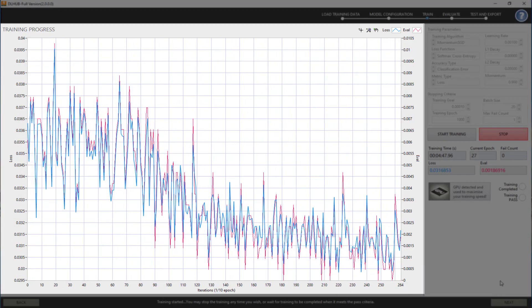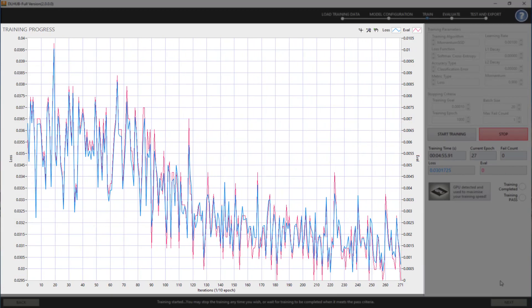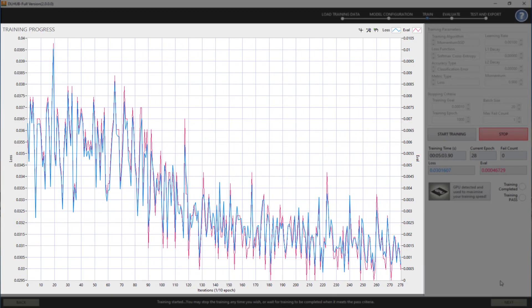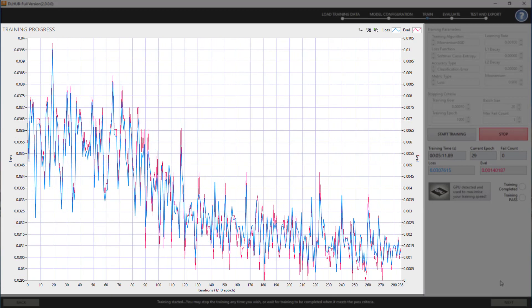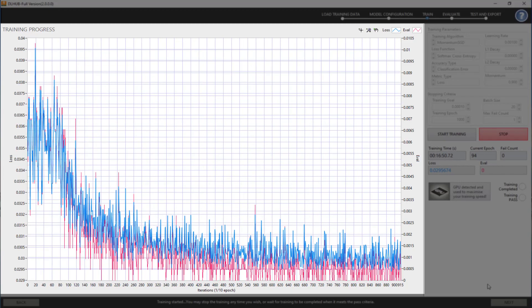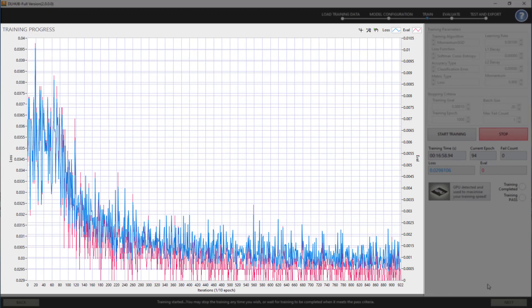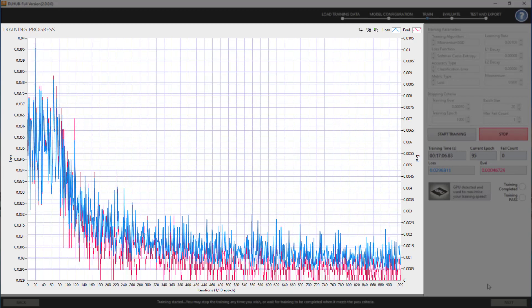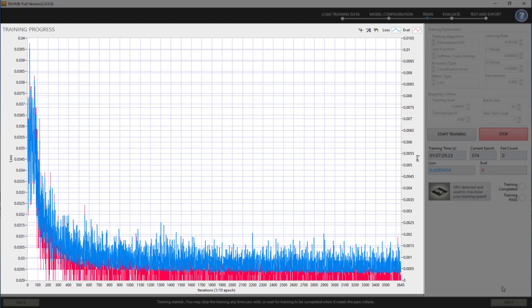DL Hub will constantly extract a small dataset to evaluate the trained model during this process. Based on that, users can stop the training anytime if necessary.